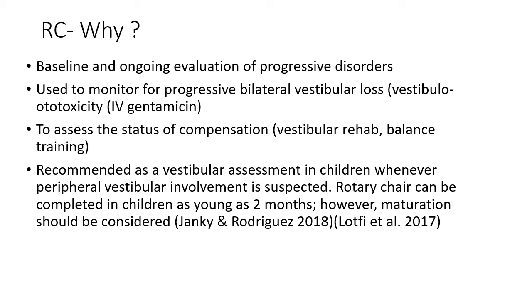Then we can use the rotating chair to assess the status of compensation due to dynamic testing across a range of frequencies and intensities after the vestibular rehabilitation and balance retraining.